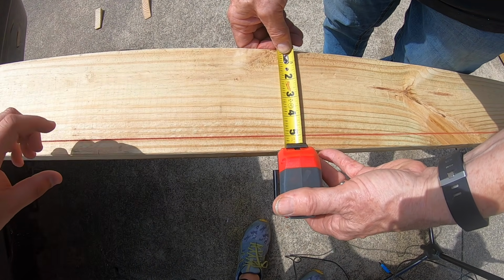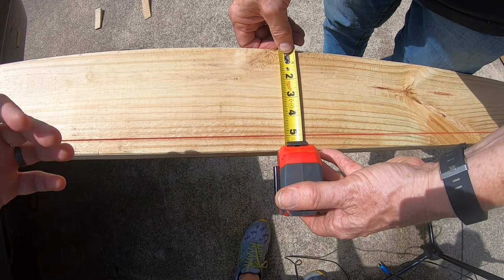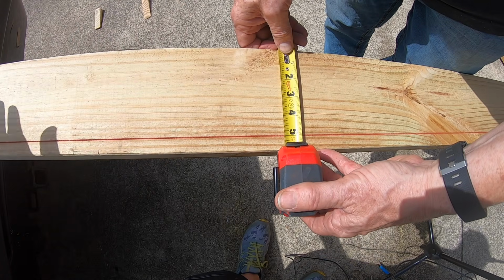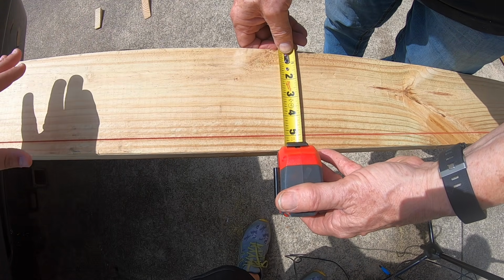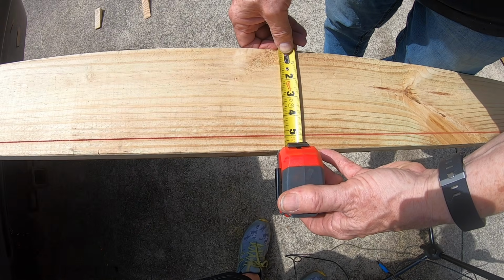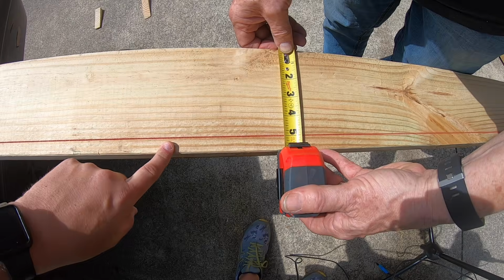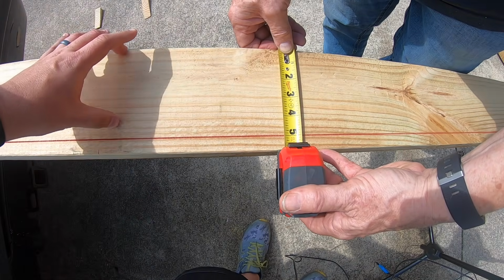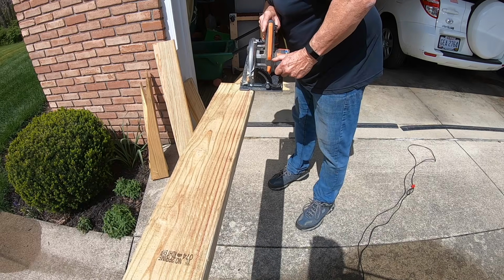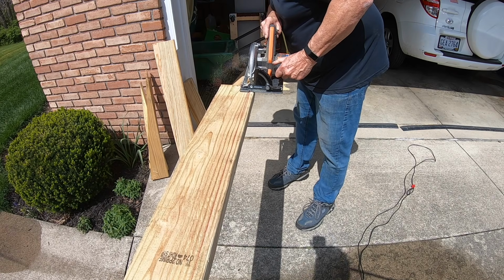One of the things we're going to have to do on the framing board is rip a little bit off because we want it to be exactly 5 inches because of how high up it was. So instead of cutting this multiple times and then having to try to rip it down, it's easier when it's in one big full piece to just rip all of it at once. We're going to take off that chunk right there, which will give us 5 inches left. That's the bad side. We're just going to pitch that. This is the side we want to keep. With a circular saw, you're going to begin cutting so we have that 5-inch area like we just said. So go ahead and start cutting.